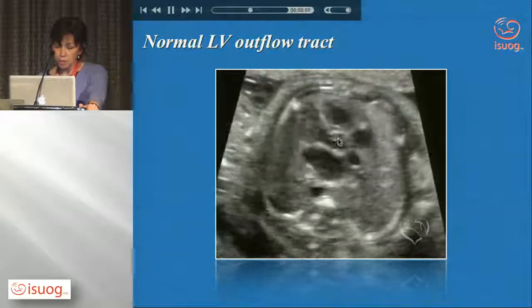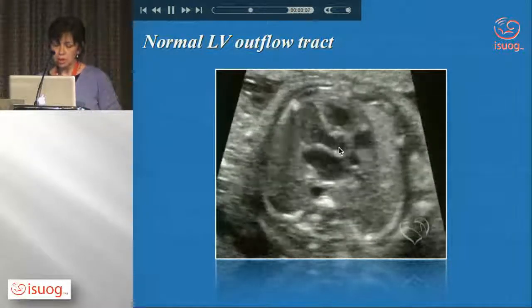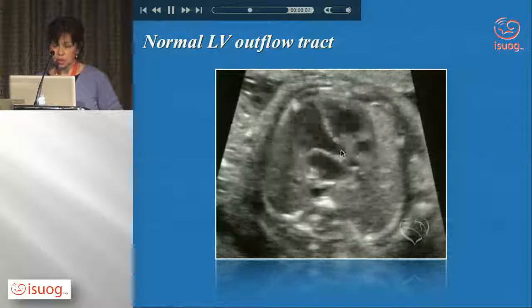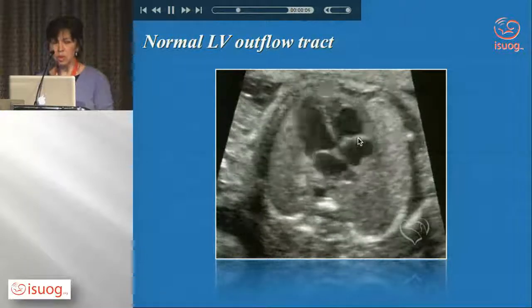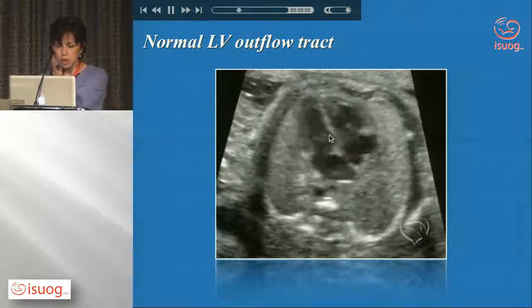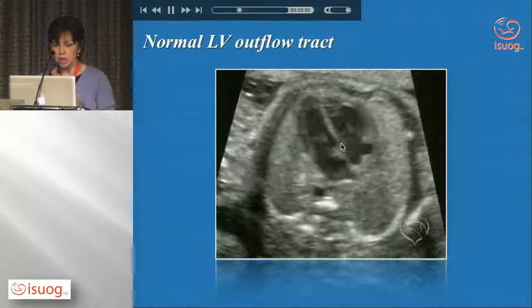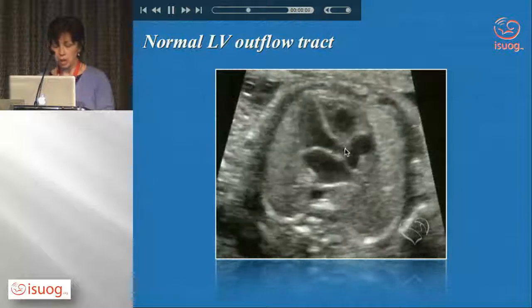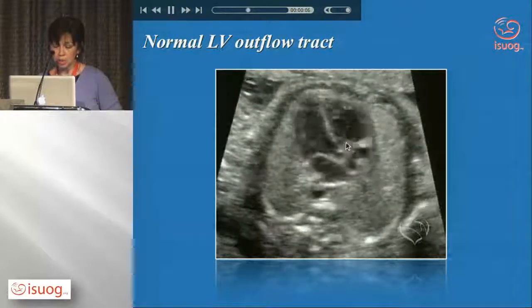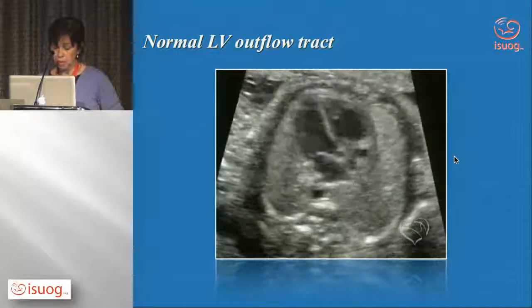In this apical view, we can see that this clip is very, very short because the aorta is starting to come, just like the five-chamber view. It is wedged between the mitral and tricuspid valves. And you only need to tilt your transducer very, very gently to get that outflow tract. If you do it too quickly, you may miss a ventricular septal defect in this area, which can be foreshortened. So it's important to do it slowly, and if the baby's moving a lot, stop and review your clips so you can adequately see the continuity between the interventricular septum and the anterior wall of the aorta, or the vessel arising from the left ventricle.